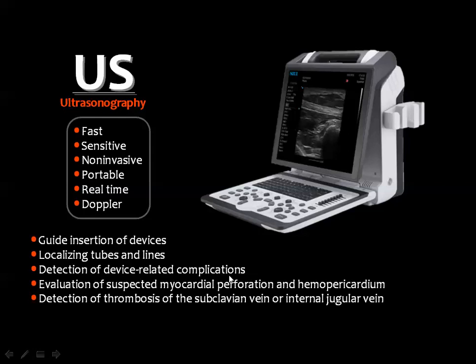Ultrasound is a very good machine to see pulmonary parenchymal lesions, pleural pathology, mediastinal abnormalities, especially if the one who is handling the probe is eminent. Then you need a professional sonographer to see all what I have mentioned in the chest abnormalities.